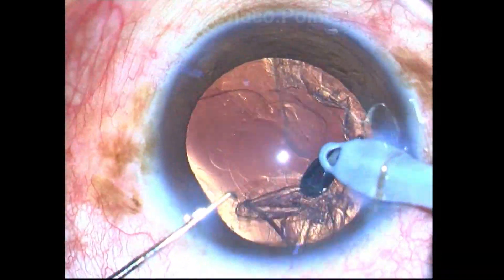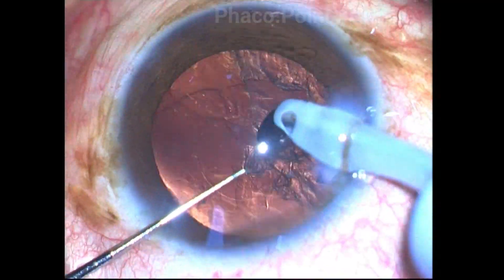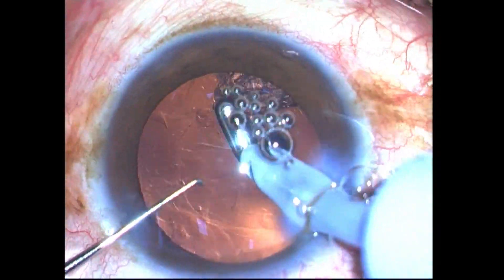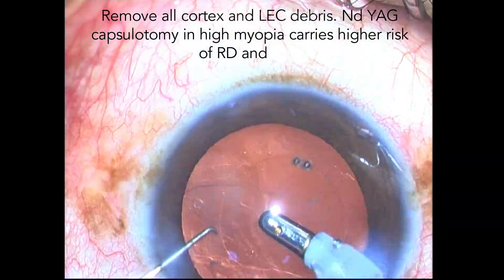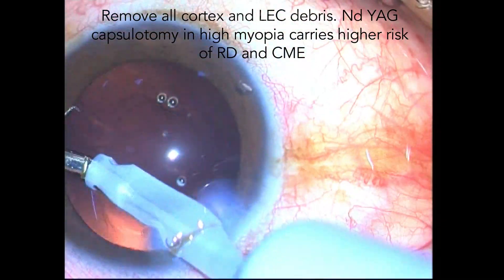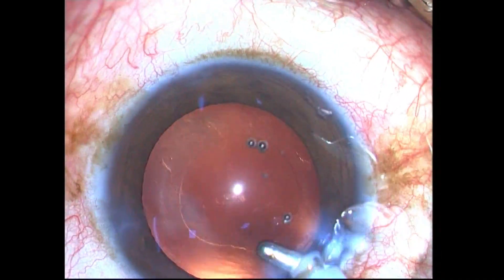The cortex is then aspirated. Please note that you have to remove all cortical fibers and scrub the capsule carefully and neatly, because if you leave residual epithelial cells behind they may proliferate, and when you perform an Nd:YAG laser capsulotomy it increases the risk of developing a myopic retinal detachment.